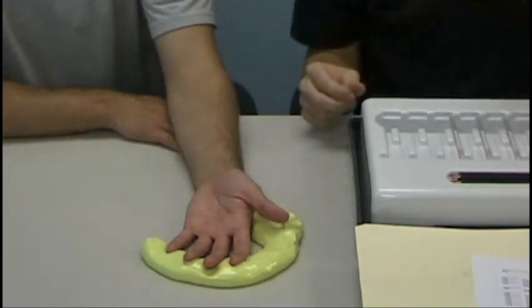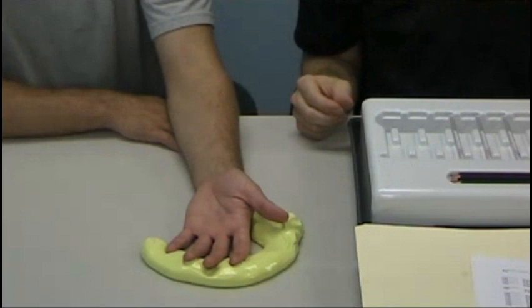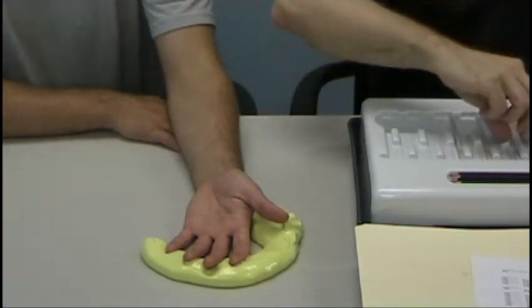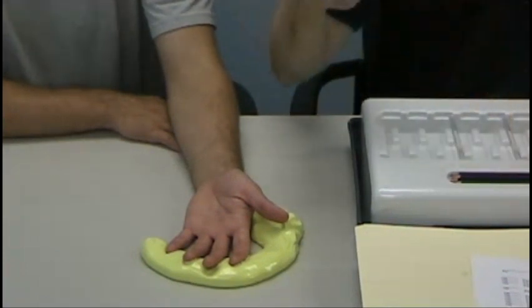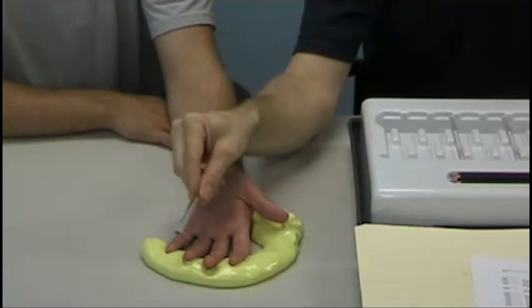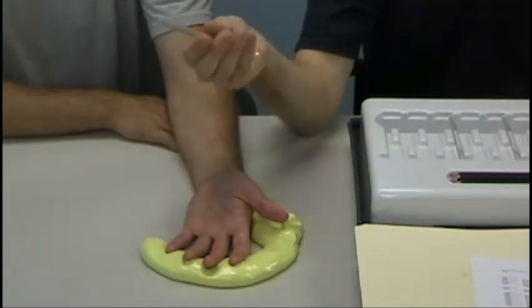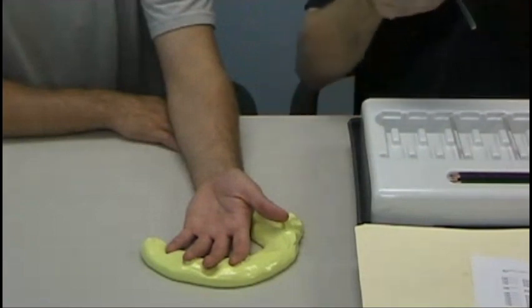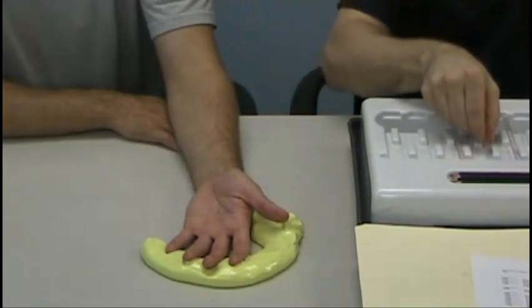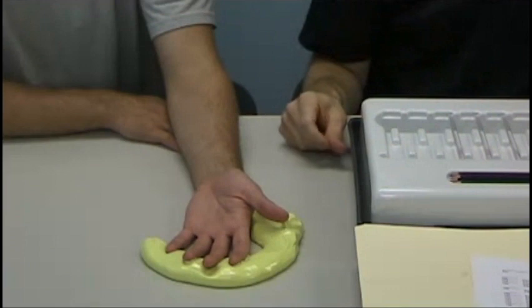With the thicker filaments, those above 4.08, the filament is simply applied once, held for a second and a half, and then released. The patient has to feel it and tell you where they felt it during that time.